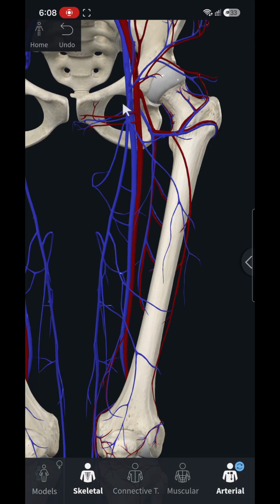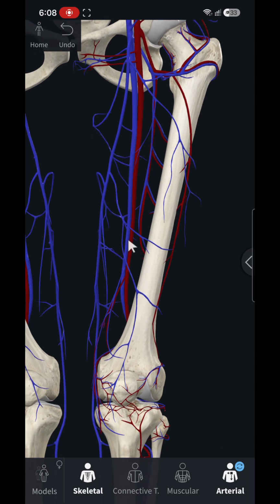First thing we're going to see here is the Mickey Mouse sign. Again, as we said, the Mickey Mouse sign is made out of the femoral vein, femoral artery, and great saphenous vein, right? And then we move alongside the medial side of the thigh. The thigh or the whole leg is placed in external rotation, so the hip joint is externally rotated, right, so that the knee of the patient is to the lateral side, so it's easy for us to scan the medial side of the thigh.